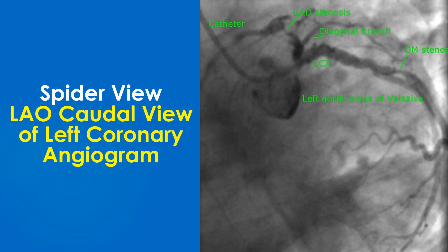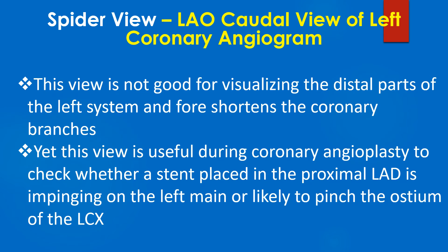This is another angiogram in spider view. In this case, the left main is not seen well as it is a delayed image. Proximal tight stenosis of the LAD is seen, as well as significant stenosis of an OM branch of the left circumflex coronary artery. Spider view is not good for visualising the distal parts of the left system and foreshortens the coronary branches.